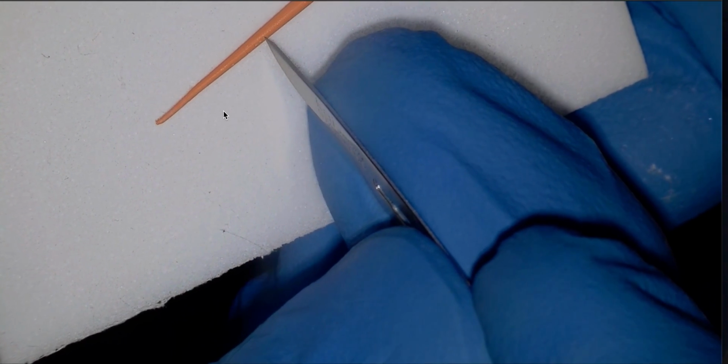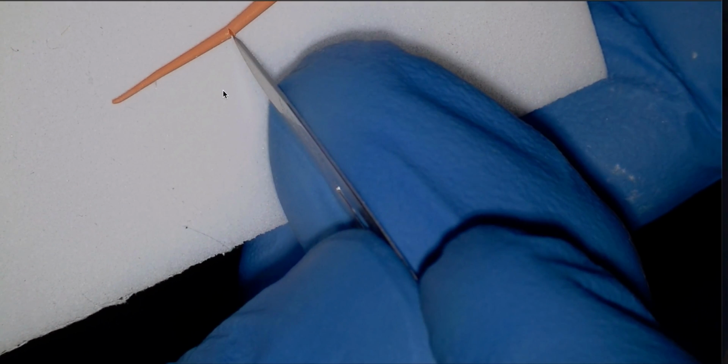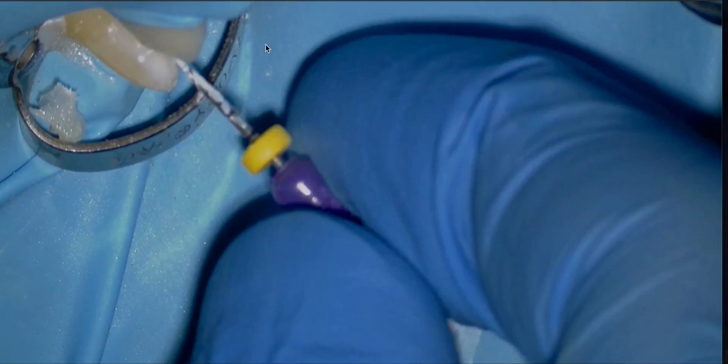millimeter plug. So really what I'm doing is I'm scoring the gutta percha, and because this is BC sealer, it's a single cone technique. All I need to do is place this cone down, take a working length, and then if I'm happy with my working length shot, I'm going to twist the top of this off and leave my apical plug in there. So that's a great technique.